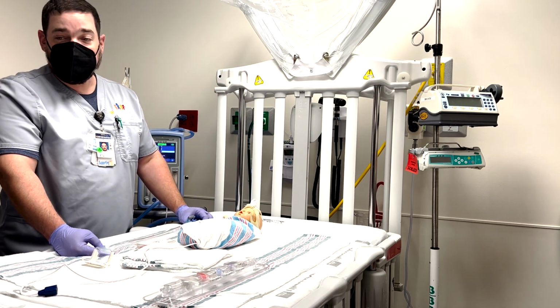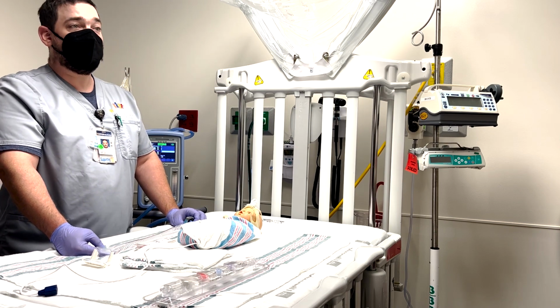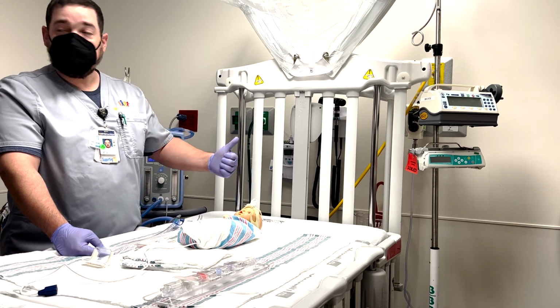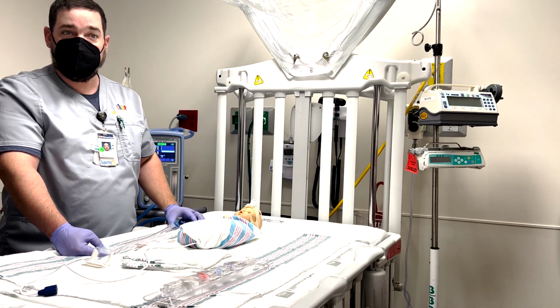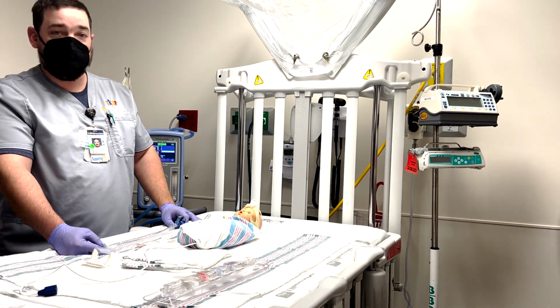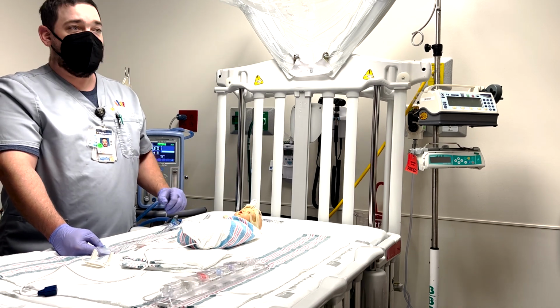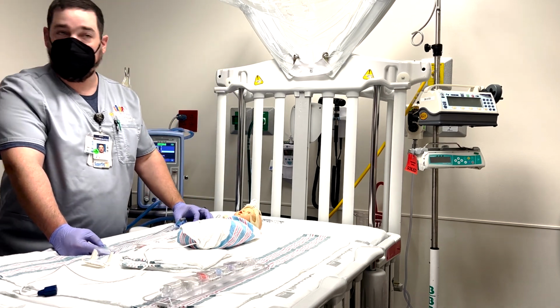And that's the other thing I want to bring up too, which is cluster care. If it's time to go in for a respiratory therapist to make a check, make a look around, change the diaper, do whatever sticks that you need to do, change the bed, whatever, occupy their time. Because if we have to bother the baby once and calm the baby once, that's a lot better than, crap, I forgot that, and then you're doing the whole thing over again.